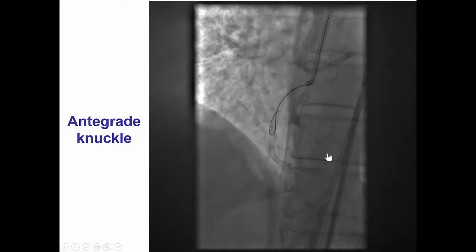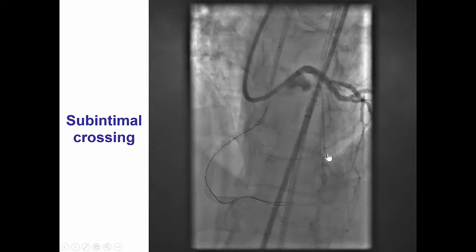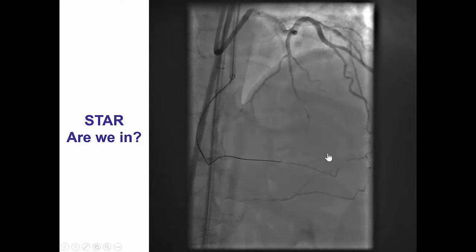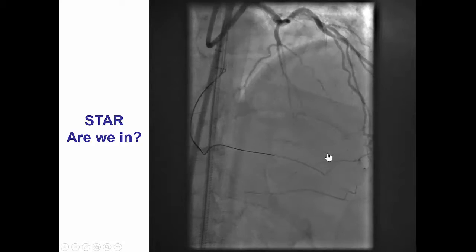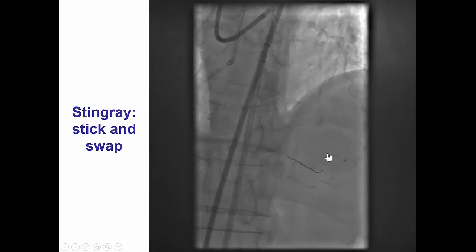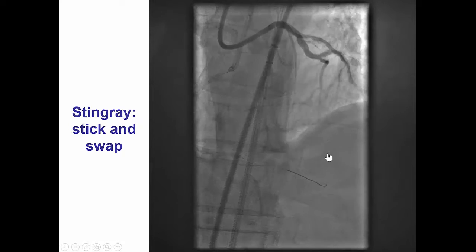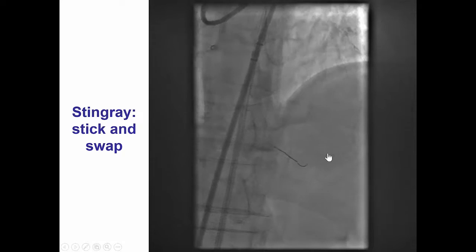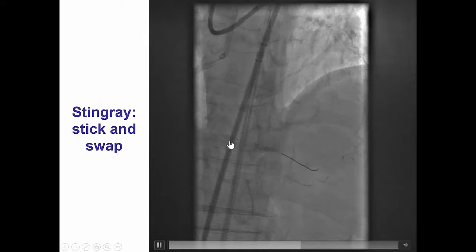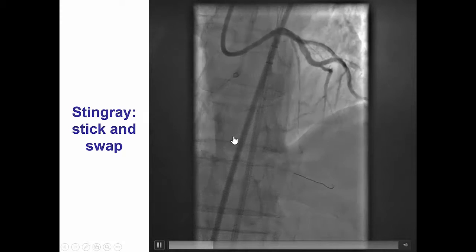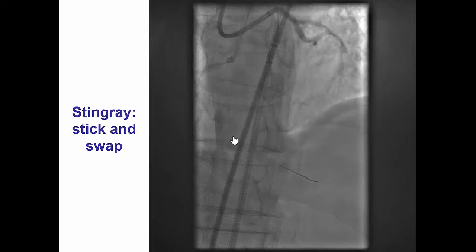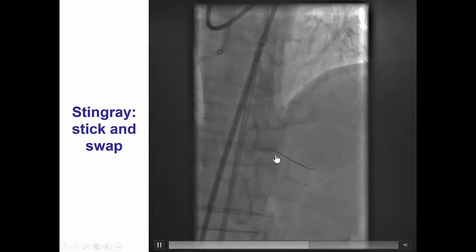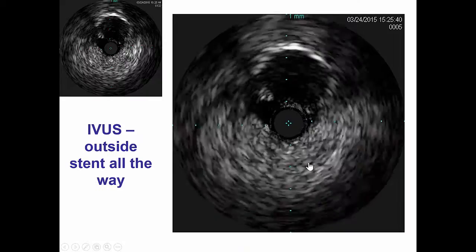As a result, given the lack of other options, we performed antegrade knuckling all the way to the posterior descending artery and then attempted re-entry into the vessel. We did not want to do the STAR technique because that would mean we would lose all the side branches. Therefore, we advanced the Stingray balloon immediately distal to the previously placed stents and performed the stick-and-swap technique by advancing a Stingray guidewire followed by a PILOT 200 that crossed into the distal true lumen, as confirmed from contralateral injection.